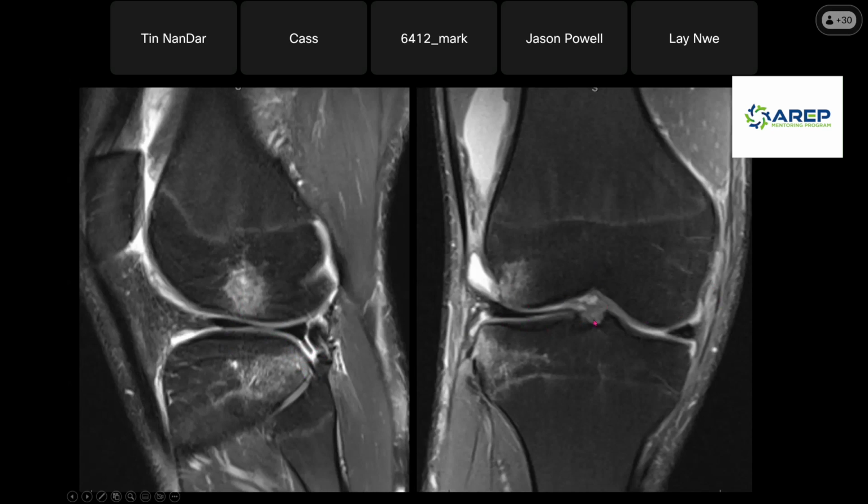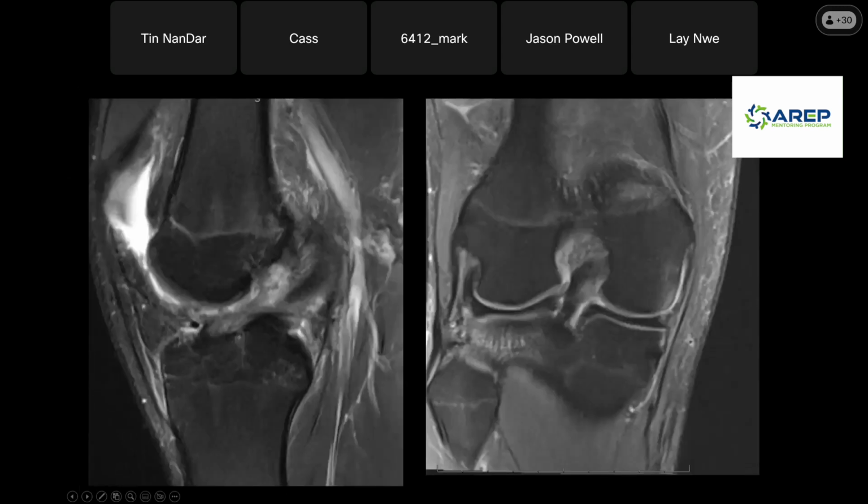The other type of injury that tears the ACL is a valgus stress injury, which happens a lot in sports, especially American football. And this person will get hit from the outside, like a direct valgus stress, and it will tear the medial structures, because you can imagine if they get hit from this side over here, it widens this part of the joint, and we call it O'Donoghue's unhappy triad, and that'll tear the ACL, the medial meniscus, and the MCL.